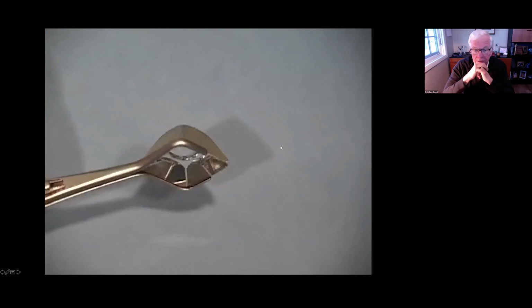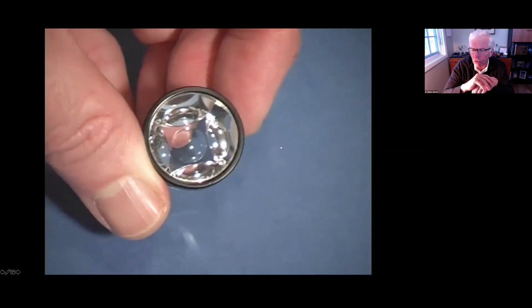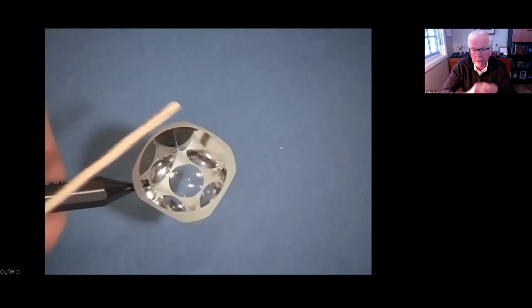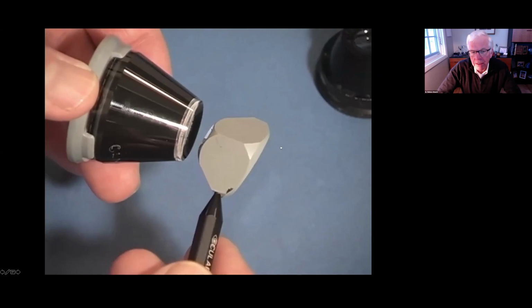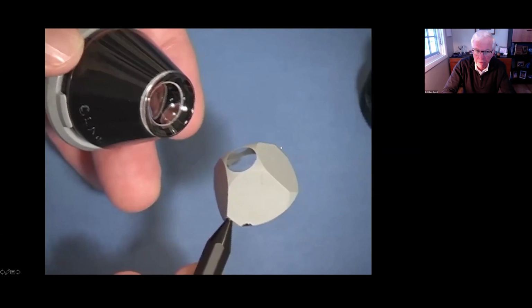This is a little bit older video. This is a Zeiss lens. Again, that's a Sussman lens. The Zeiss lens was great, but it's very fragile. And this is the Posner. And so there are four mirrors, as I'm pointing out here. And this is just showing that the Posner, Sussman, and Zeiss lenses are smaller. The area of contact is a lot smaller than with the Goldmann lens. And that's important for indentation or dynamic gonioscopy. It's very hard to indent with the Goldmann lens.